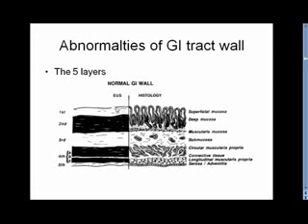On endoscopic ultrasound, the first layer, which is bright or echo-rich, is actually a border echo. It's part of the mucosa. The second layer is dark and also belongs to the mucosa. The third layer on endoscopic ultrasound corresponds to the histological submucosa. And the fourth layer, which is again dark or echo poor, corresponds to the muscularis propria.